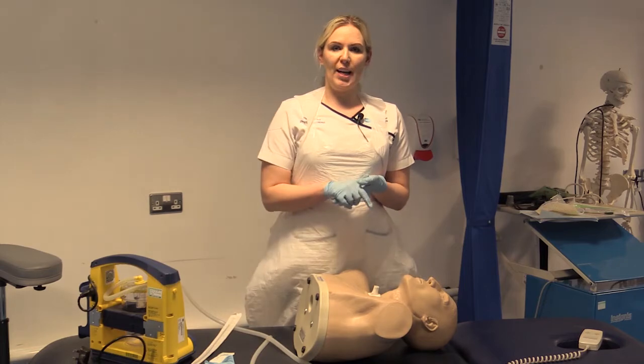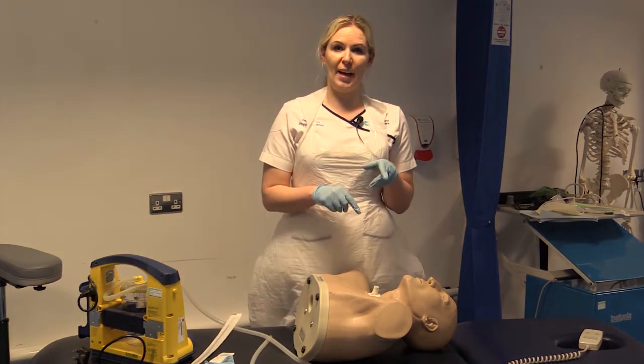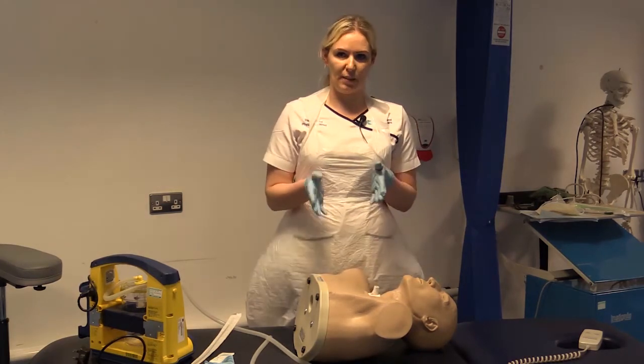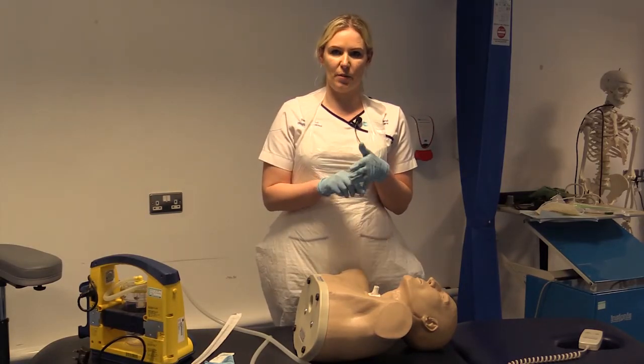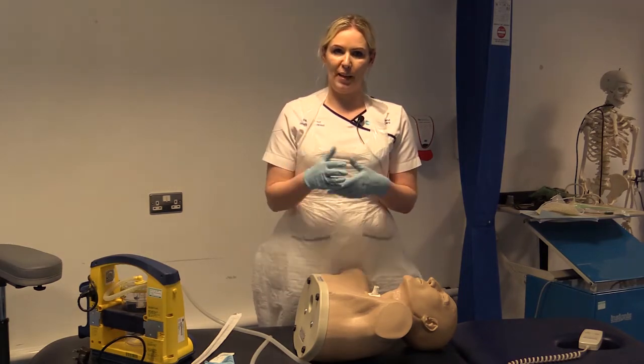So in this video we're looking at suction via tracheostomy, mini tracheostomy, and the same principles will also apply through a laryngeal stoma. Obviously the patient won't have a trachea in place, but the exact same principles apply. As previous, you've established your need for suction, you've checked your patient's medical notes, and you've gained informed consent where possible. You've washed your hands and you've put on your appropriate PPE.